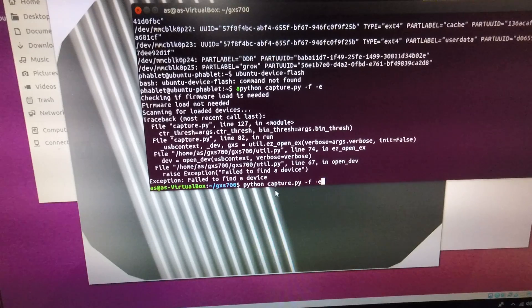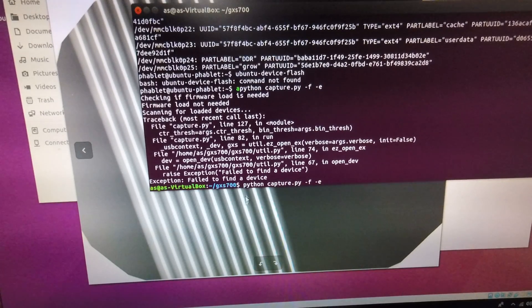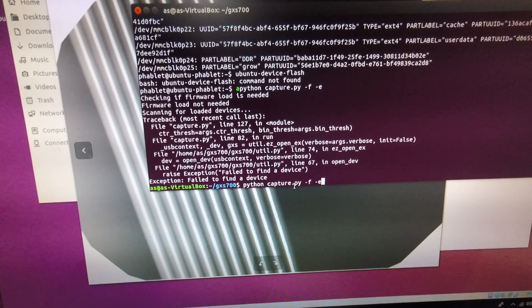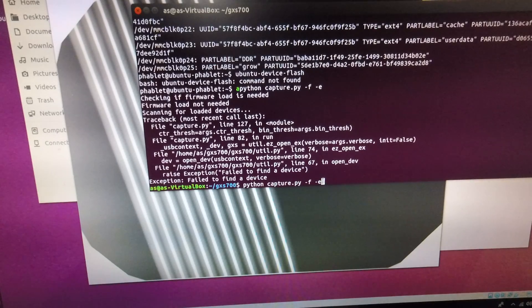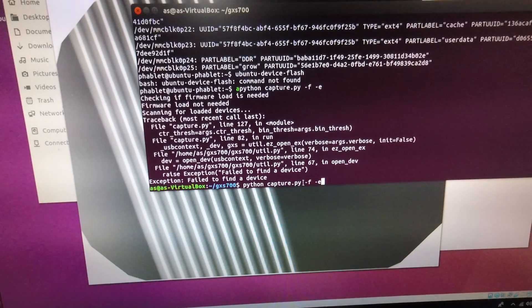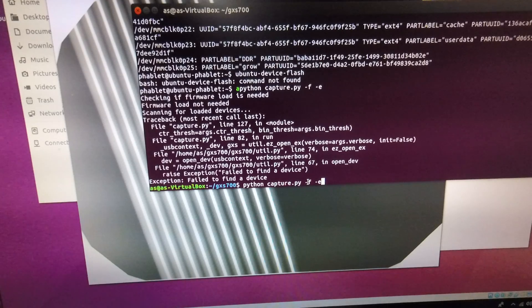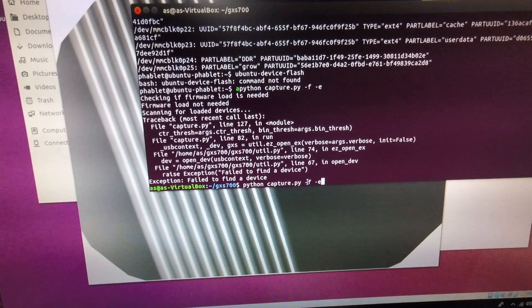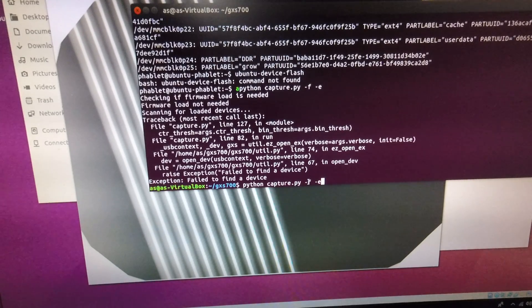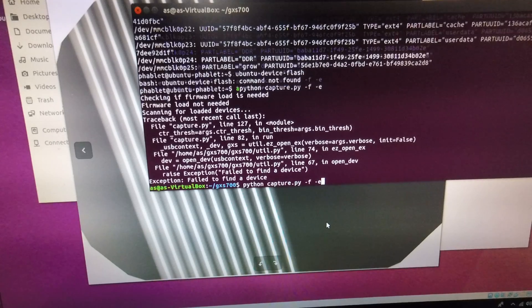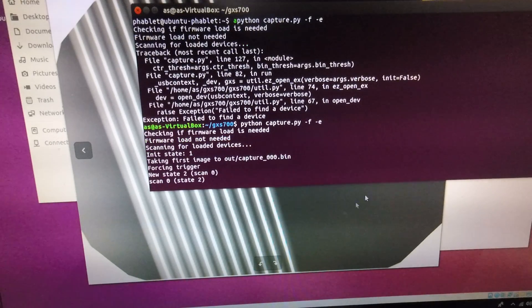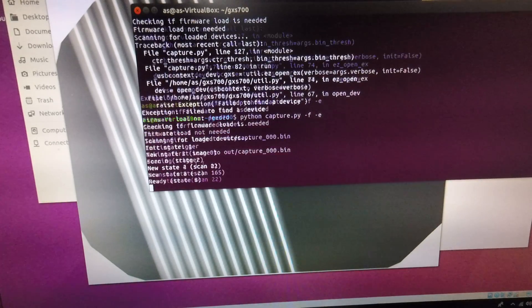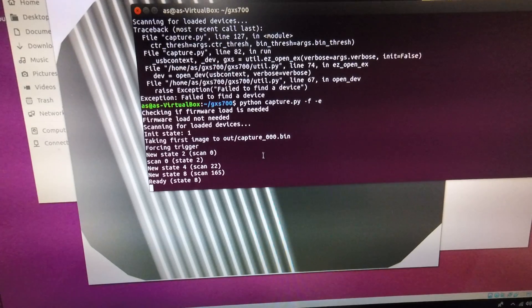So I'm going to do a dark field capture. The command is python capture dot py dash f dash e. Dash f forces the trigger without x-ray exposure. Normally the sensors would just be auto triggering and the dash e does histogram equalization. So it's going through the triggering. It's taking the image.